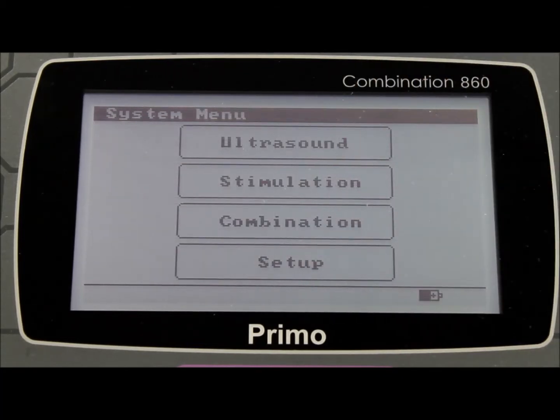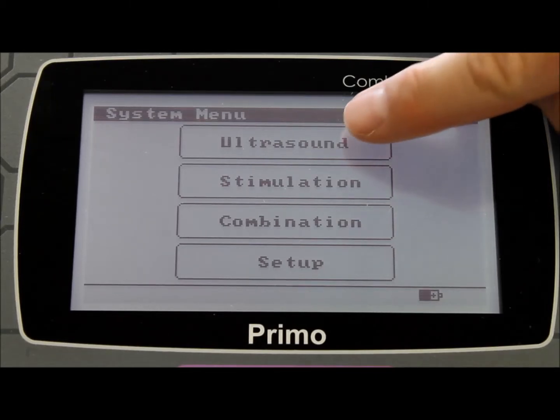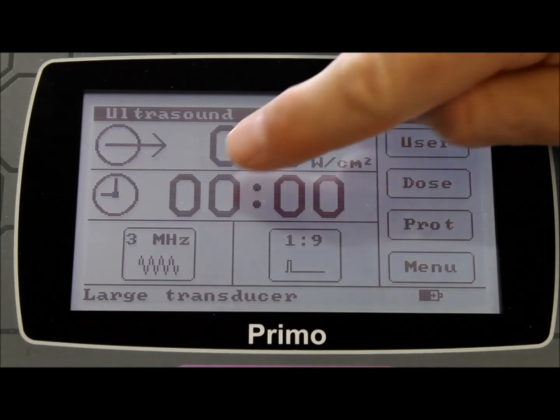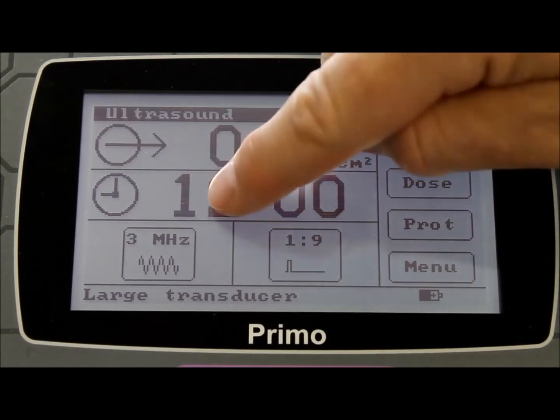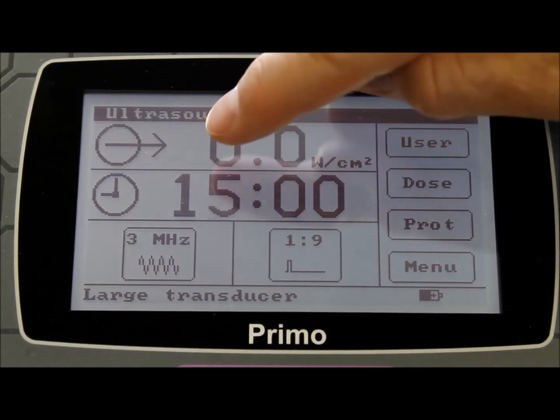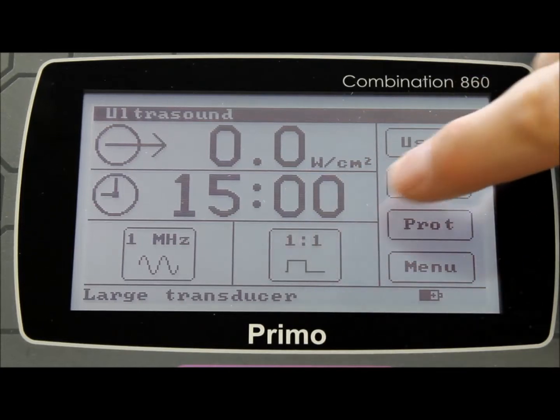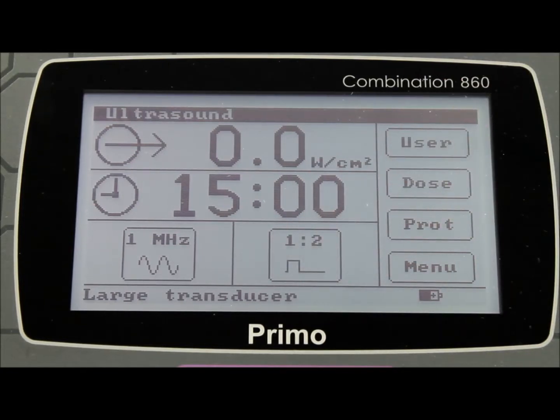Simply press exit to return to the main menu. Let's take a look at the ultrasound modality first of all. For those familiar with the Primo Therasonic 360 or 460 ultrasound only units, the setup screen will be the same on the combination unit. Simply use the touchscreen to choose your treatment time, the frequency output, the pulse mode, and then you're ready to begin treating the patient.